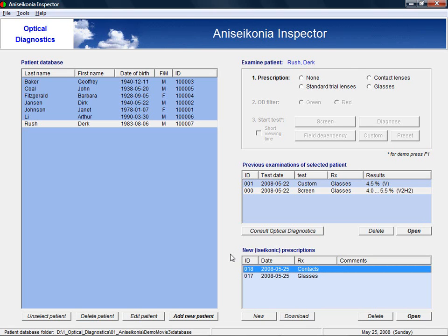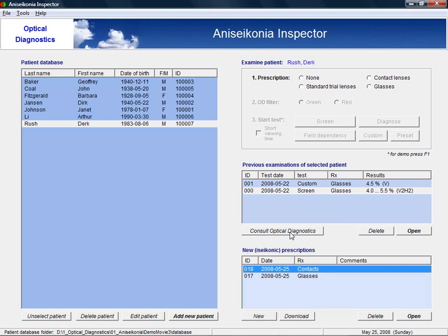Even though this demonstration showed you that aniseikonia management can be easy, it might be good to know that the software includes the possibility to consult with Dr. DeVitt from Optical Diagnostics about your case. This might come in handy if you have a difficult case or if you only rarely deal with an aniseikonia patient and would like to outsource the design of new prescriptions.